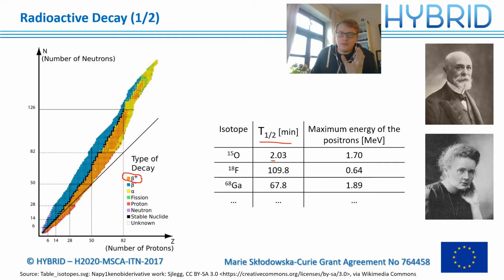And the most commonly used is 18F. So this has got like a 2 hour half-life. So it can, for example, accumulate in your body for an hour. So mainly used with sugar as well. Accumulate in your body for an hour or something. And then you can see where tumors are. And then there's also some other isotopes with a middle half-life. This was mainly used for PSMA, the prostate-specific one.